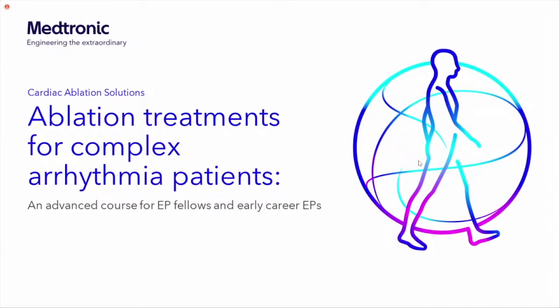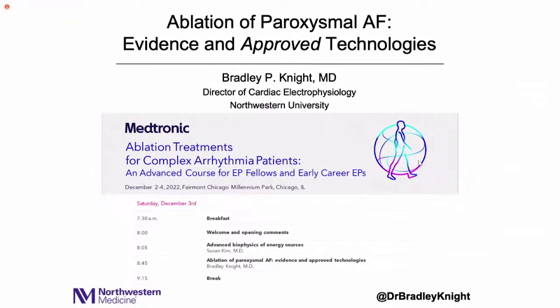Yeah, that's a great question. So actually, Mahmoud and I did this yesterday a lot. I opt for high power, short duration. In theory, it's a shallower lesion. You get more resistive heating and less conductive heating, so less deep of a lesion.